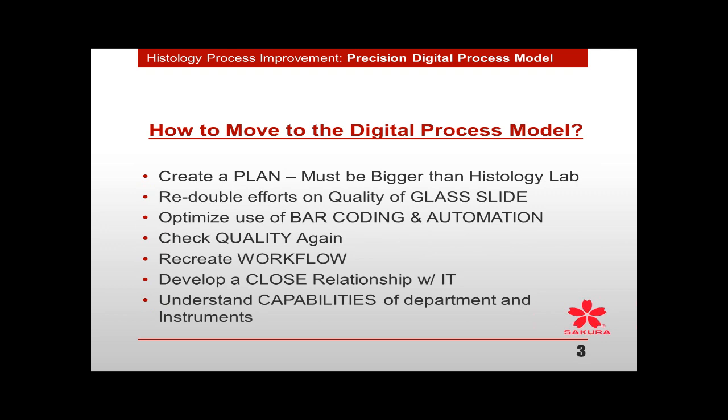So how do we move to this? Again, this is about sitting down and planning. You've got to create a plan. It's got to be bigger than your histology lab. It's got to be mostly IT. You don't want to shut down your systems because you're now sending off these large images all over your system.